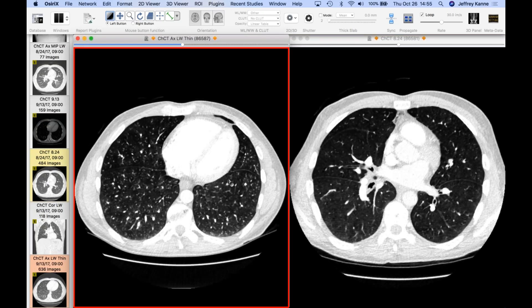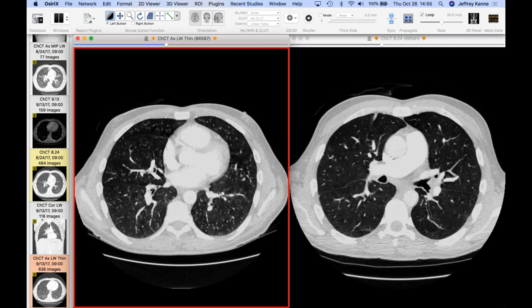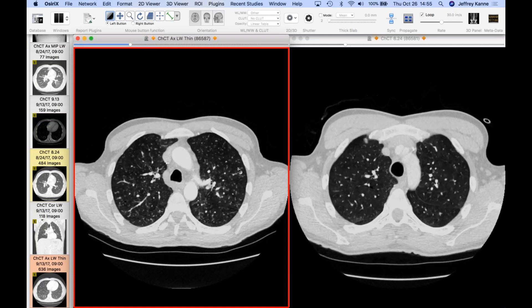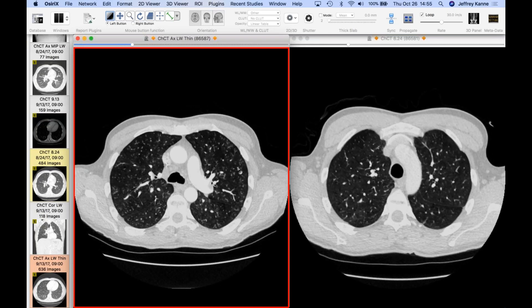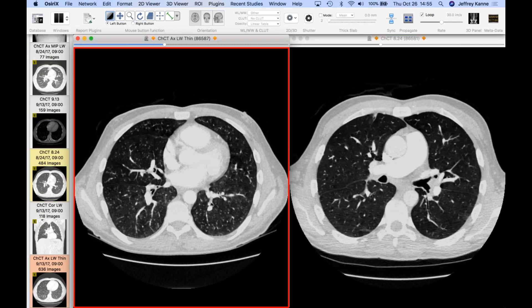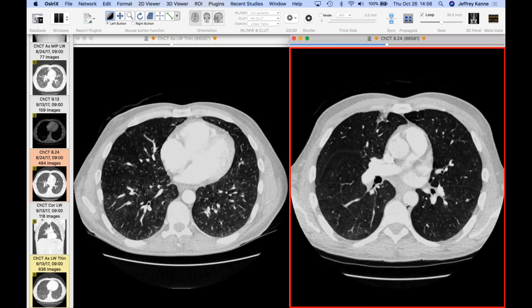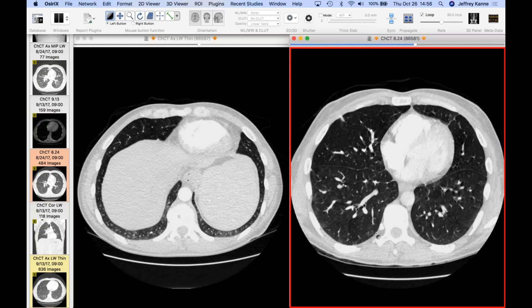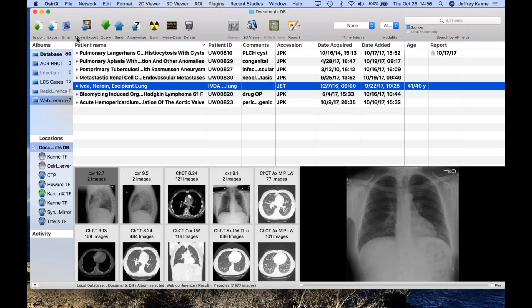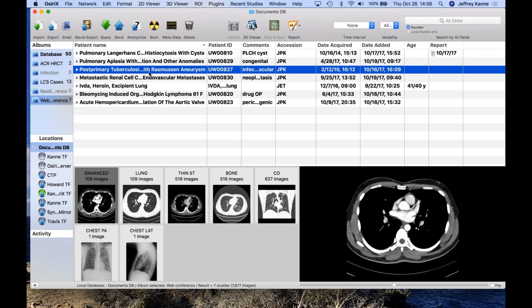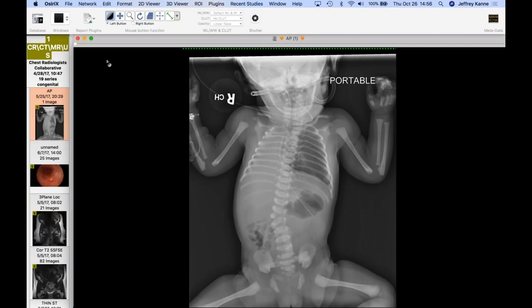This looks more like a vascular cause — it looks like acute pulmonary hypertension, a vascular cause of tree-in-bud. This guy was actually injecting heroin intravenously. So this is presumably an arteriopathy and some sort of incipient lung disease. Some of these areas in the older scan were probably subacute septic infarcts or septic emboli from earlier. There's also a little mosaic attenuation — probably from previous insults. A quite dramatic change over just a few weeks. When you see tree-in-bud in absolutely every portion of the lung, think of IV drug use — it just seems like it's never an infectious bronchiolitis if it's uniform and involving everywhere.